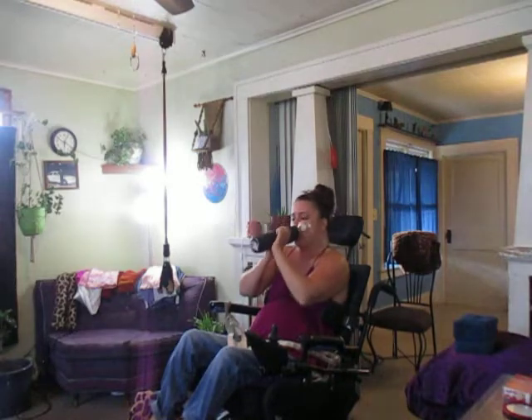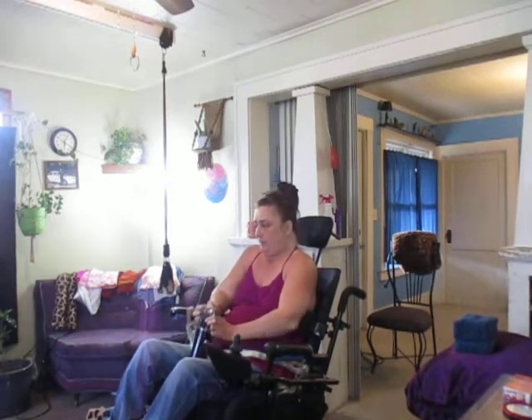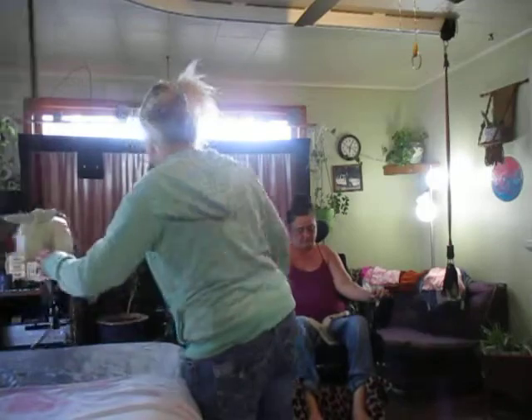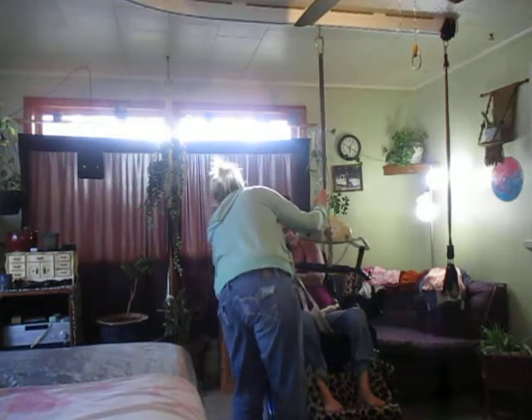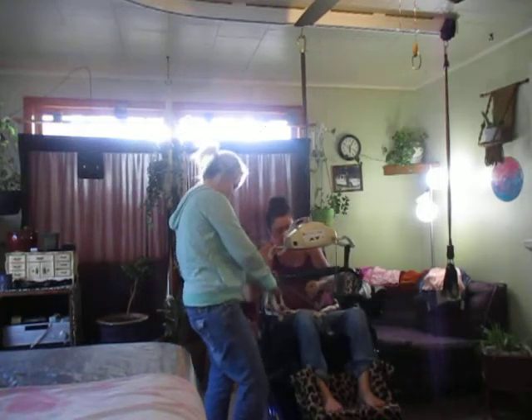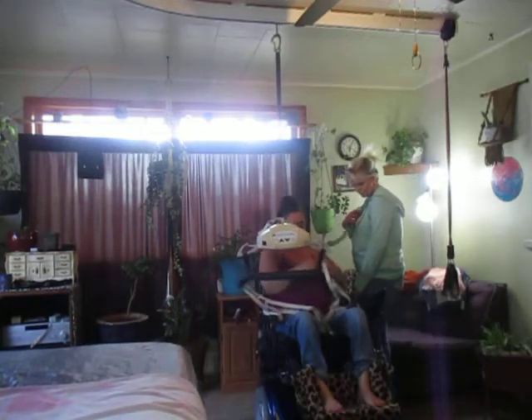All right, I'm going to lift so you guys can kind of see how it scoops around me. My neighbor's mowing his yard still. All right, I'm on the track. I hook them on the bottom — you can use the top; we use that for the shower. I have a different sling for that one too. But when I lift, I'll show you around my butt cheeks.